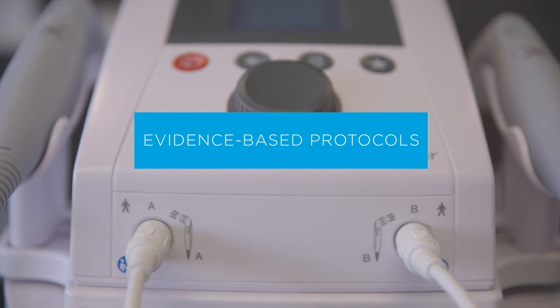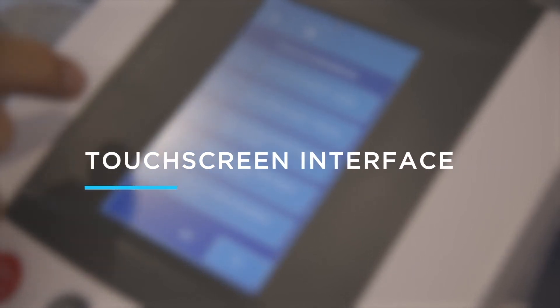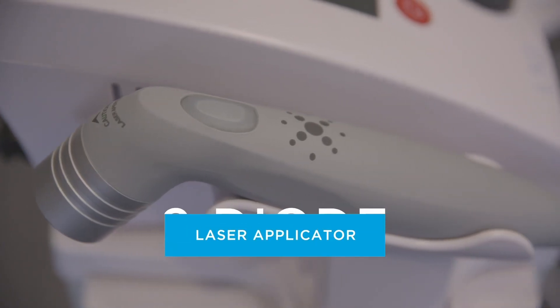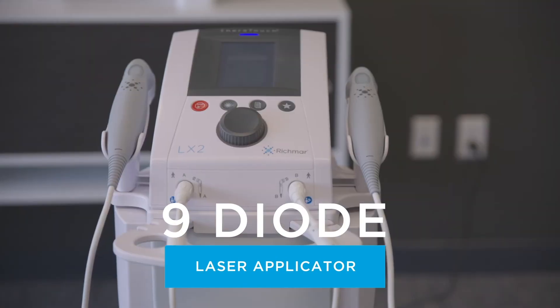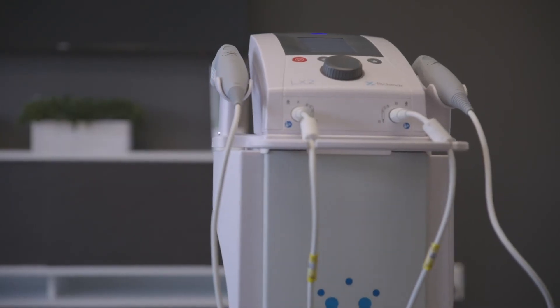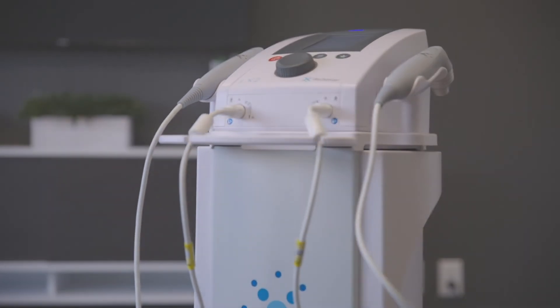Taking into account the many great features such as selectable evidence-based protocols, touchscreen interface with built-in dosage calculator, and an included 9-diode laser applicator, it's easy to see how the Theratouch LX2 clinical laser provides exceptional value and capability to you and your practice.